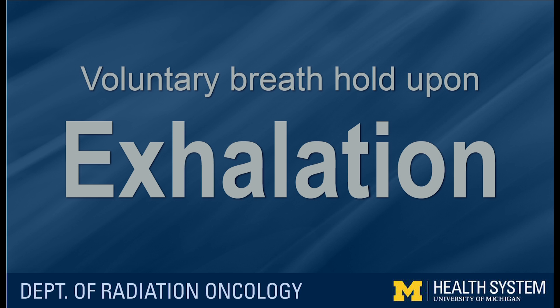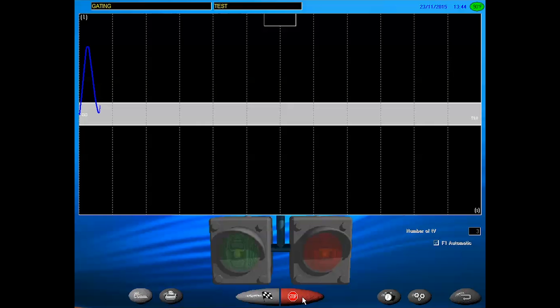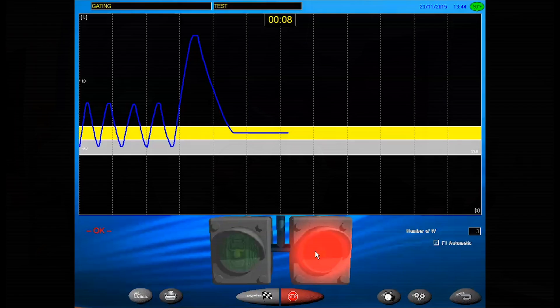The exhalation method is much the same. Take a series of normal, even breaths — breathe in, breathe out — and allow your exhalations to fall in the middle of the gray band. Once a rhythm is established, your therapist will ask you to take a deep breath in. The green light will go on and you will be asked to gradually exhale and hold your breath within the yellow band. You'll see a timer showing your breath hold duration. If you are unable to comfortably hold your breath for the specified length, resume normal breathing and the process will be repeated.